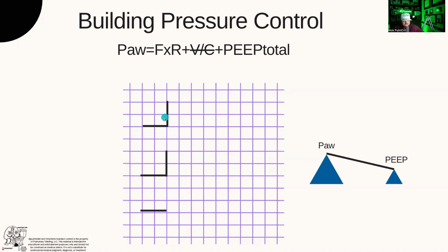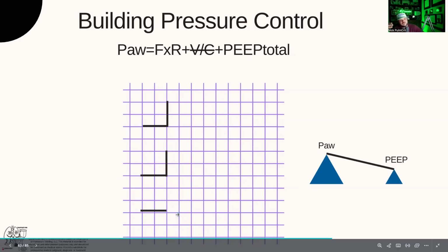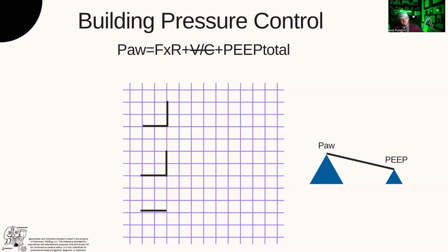So you have a delta of 15. So we added 15 of pressure. In that initial second, or split second, you have this massive difference in pressures. So you have this massive upstroke in flow. Initially you have a massive upstroke in flow, but you don't have any volume just yet because you just generated flow. Now, as you have flow over time, you'll generate a volume.